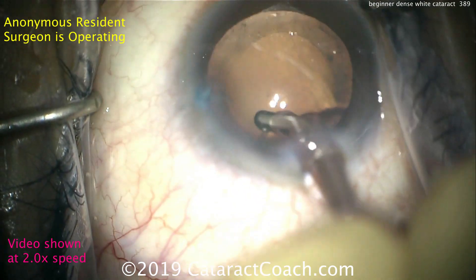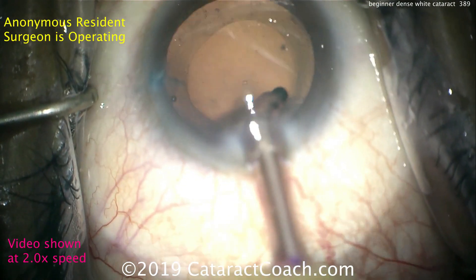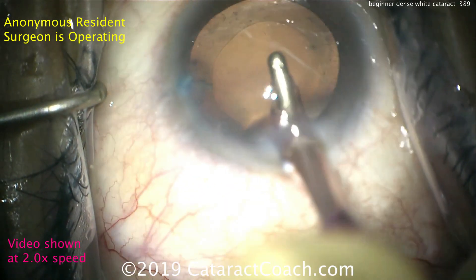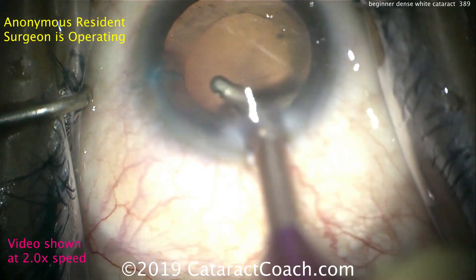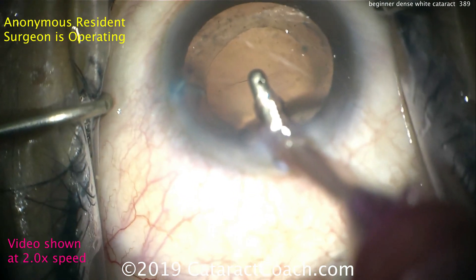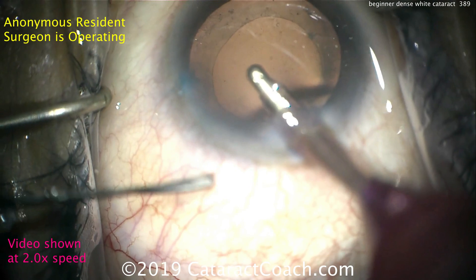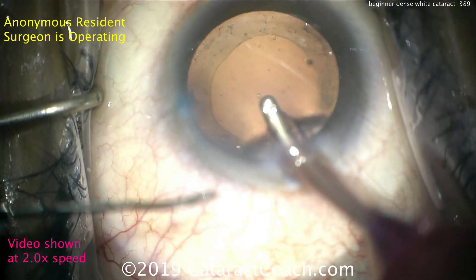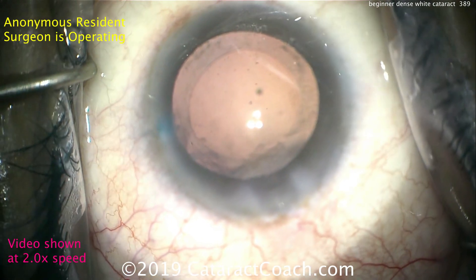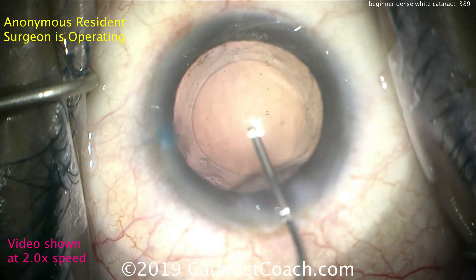Beautiful technique, very nicely done. The surgeon certainly gets an A for effort and technique, and so far the results look great. Look at that paracentesis — there is a little nuclear piece stuck in it, that blue-stained paracentesis. Last bit of the sub-incisional cortex being removed. Now we go to that paracentesis — the piece is still there. Here I'd use a spatula to help free that piece out; either it'll float outside the eye or go back in. In this case it's removed. There's the rexis — some anterior capsular polishing can be done here, though that's a more advanced technique.